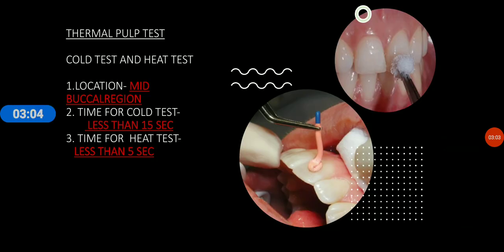Okay, now the thermal pulp test. It includes the cold and heat test. Now, location. The source is applied on the mid-buccal region. Why? Because the enamel in this region is thinner than in the incisal region, and we don't apply it on the cervical region as it can cause damage to the gums or the soft tissues, right? Now the time, I have mentioned it. For the cold test it is less than 15 seconds, and for the heat test it should be less than 5 seconds.